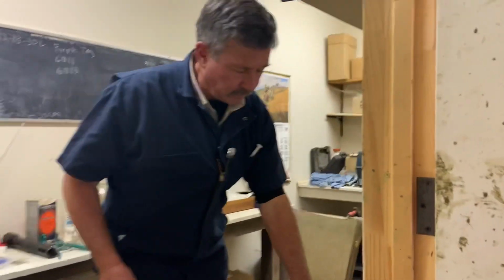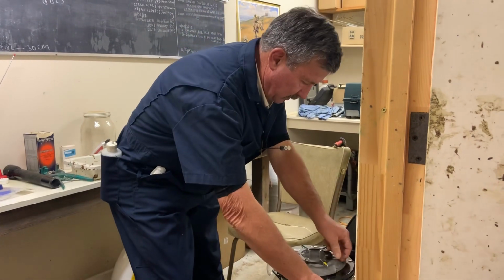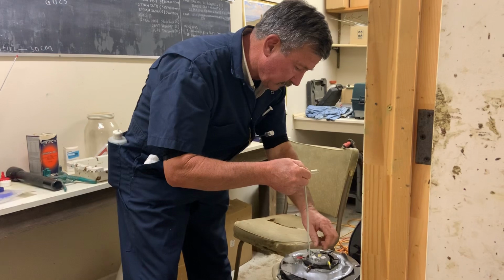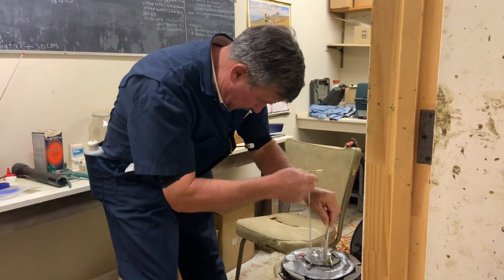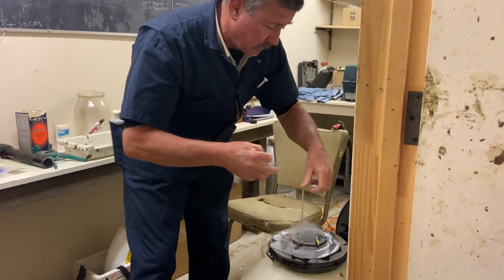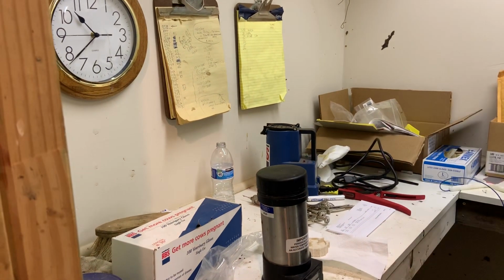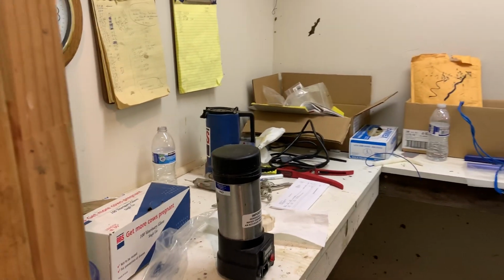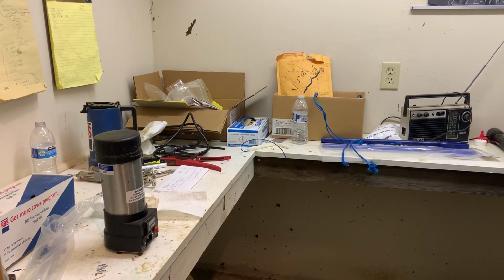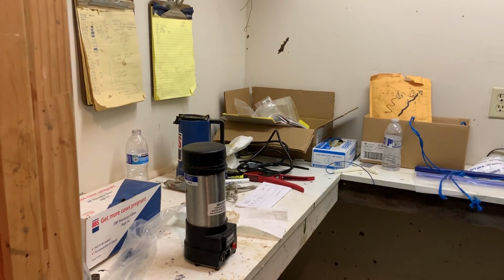So we're gonna go ahead and pull our semen out now to thaw. And it's in cane number 1. So why do you need to freeze the semen? Preserve it. Okay. How long can it last if it's preserved? So we're gonna put this into a straw warmer. That water is already at a preset temperature for thawing, and we're gonna let it sit in there for about 30 seconds. Kind of a minimum of 30 seconds. It can stay in there longer than that.